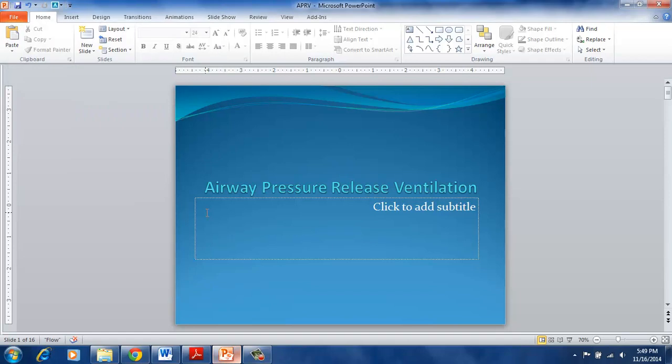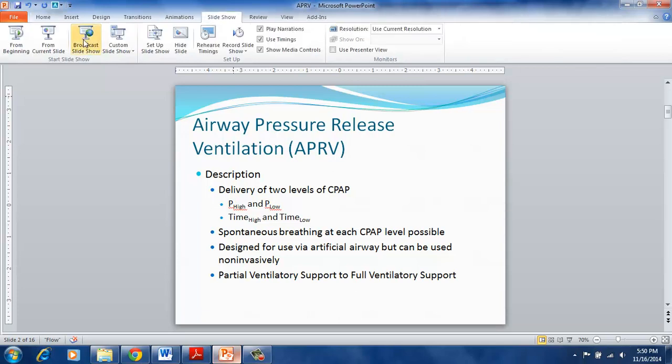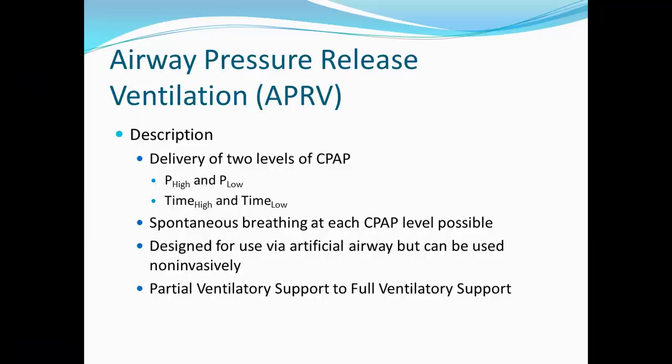Okay, I'm going to do a very brief description of airway pressure release ventilation, or APRV. We decided to do this based upon the discussion board and Blackboard Collaborate because several people in the class don't have experience with APRV, so we decided to do this to see if it would be beneficial for them.